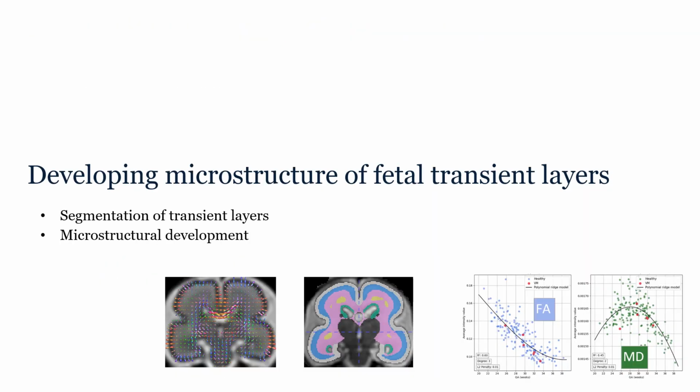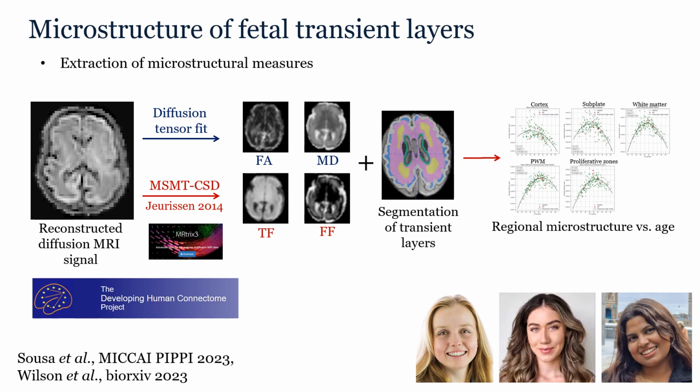Finally, I will briefly describe our recent study of microstructure of transient layers in developing fetal brain. This study uses fetal diffusion data from the Developing Human Connectome project and was done by Sean, my PhD student Helena, and my undergraduate student Ami.